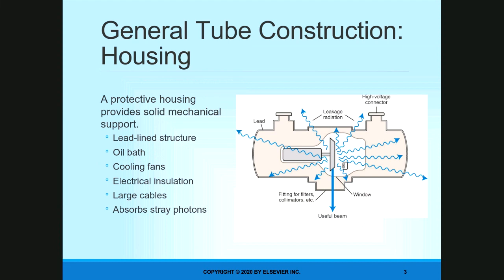When we start off, before we get to the actual X-ray tube, we have the tube housing. And this is a picture here that you can see of the tube. This is the X-ray tube that we were just looking at. This is the anode, this is the cathode, and this right here was the Coolidge tube that both electrodes were contained in. But it doesn't just sit out over the patient open like that. It's actually contained within a protective housing.